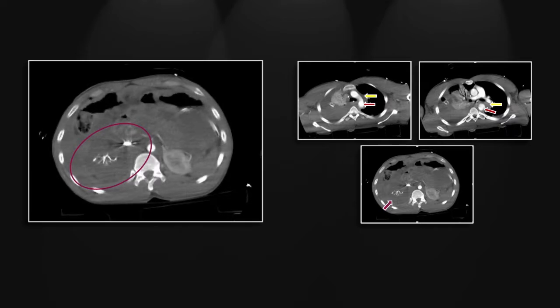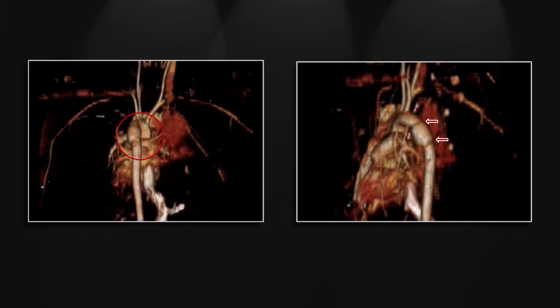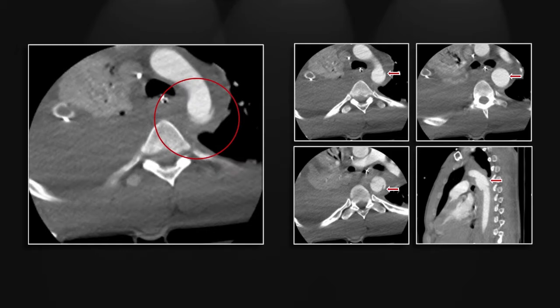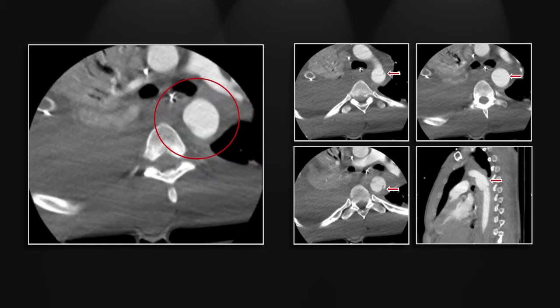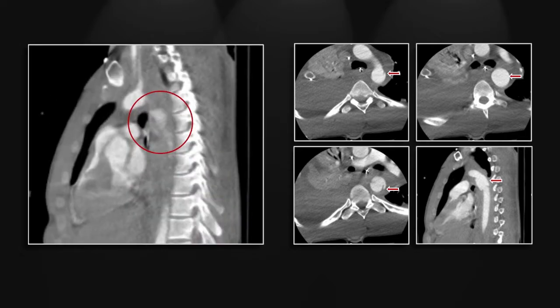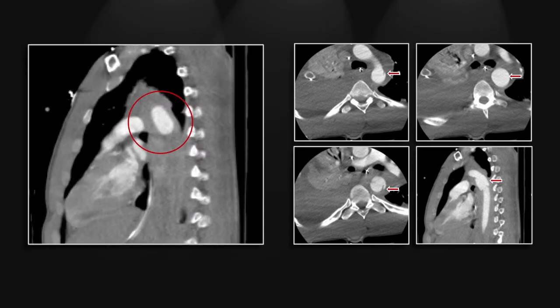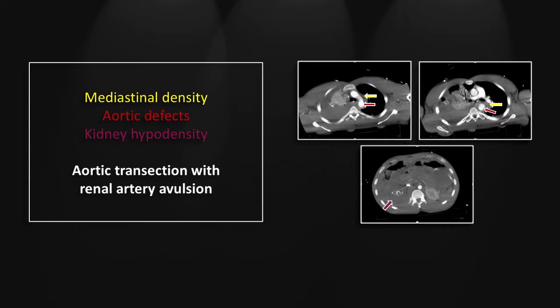Again, a markedly asymmetric nephrogram indicating the loss of arterial flow to the right kidney. The three-dimensional view is helpful here to visualize the transection with the retraction of the torn ends of the aorta and an intervening segment of pseudoaneurysm bound by adventitia. Here is a magnified view and the sagittal — very helpful in visualizing an aortic transection. So this was an aortic transection with avulsion of the right renal artery.